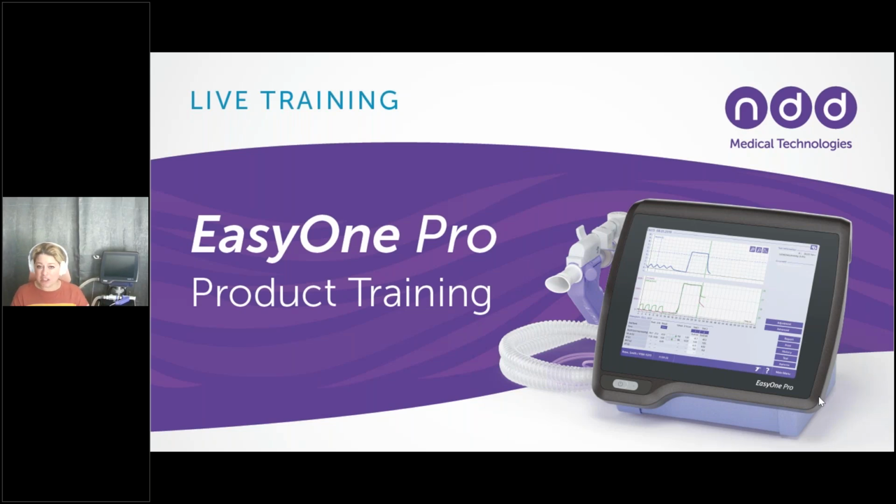Next month, we're going to actually be focusing on the Pro Lab device and walking through the SVC test, or the slow vital capacity, and the nitrogen washout or multiple breath washout test to get TLC on the Pro Lab device. So if that is you, or if you want to learn more about that test, be sure to register.